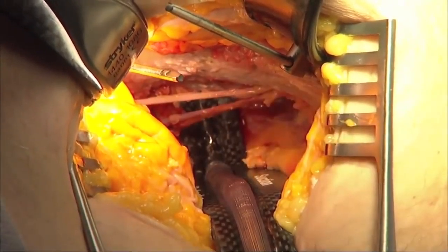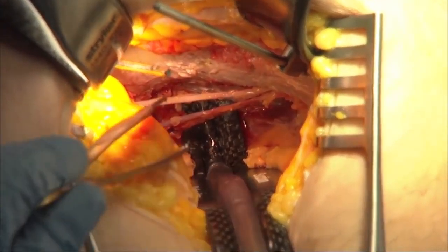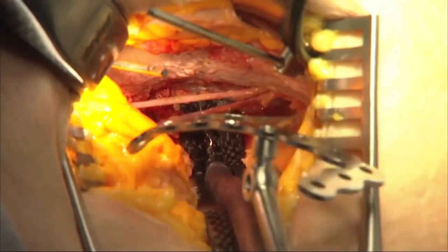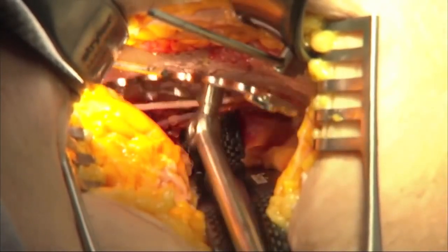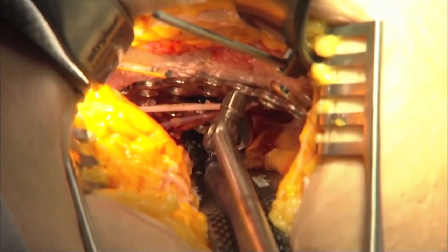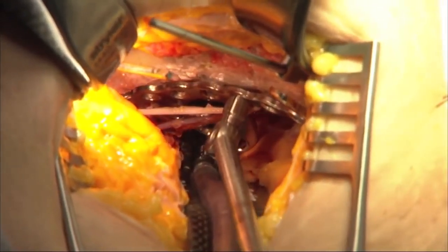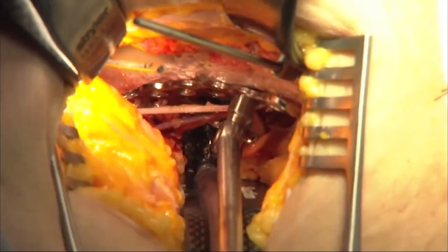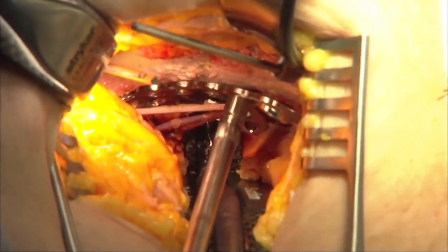The plate screw insertion handle allows you to insert the plate just lateral to the nerves and nicely control the plate and position it and hold it where you want it while you're putting the screws in, and also to ensure that the correct size has been chosen. The nerves back here, we slide the plate just lateral to the nerves.